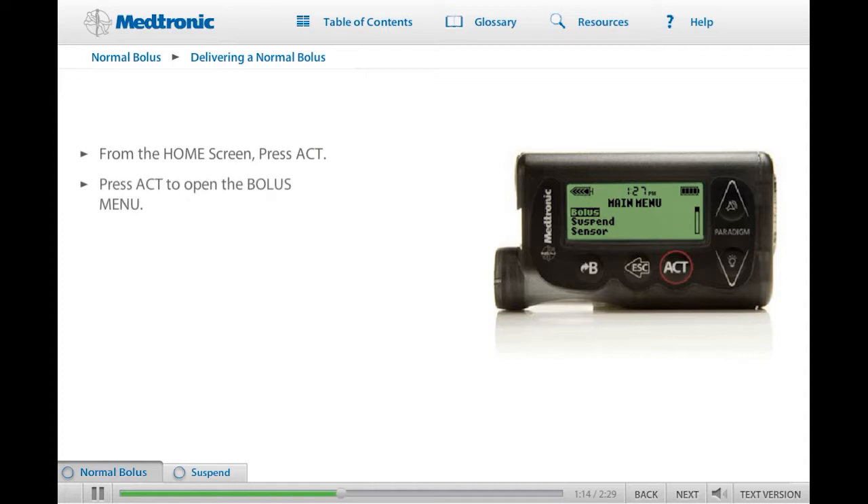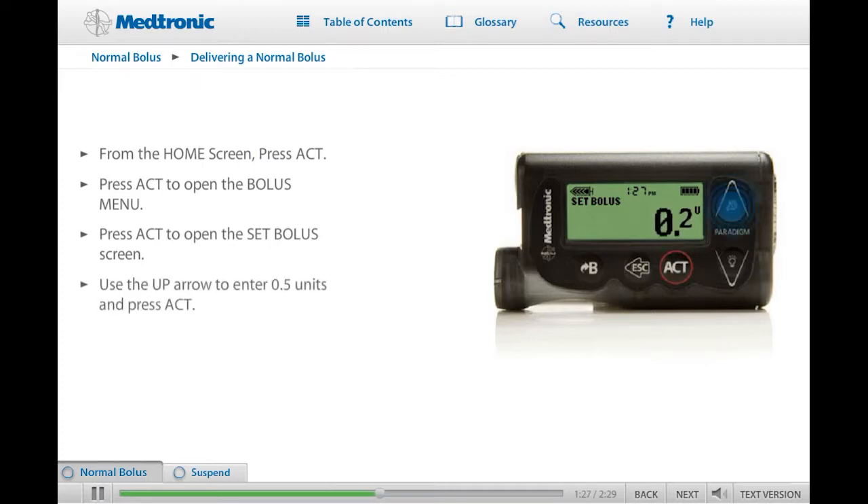Press Act again to open the bolus menu. Set bolus should be highlighted. Press Act, and the Set Bolus screen appears with zeros flashing. Using the up and down buttons, enter 0.5 units. Press Act. The bolus delivery screen displays as the bolus delivers. When the bolus amount is less than one unit, your pump will deliver in 0.025 unit increments.